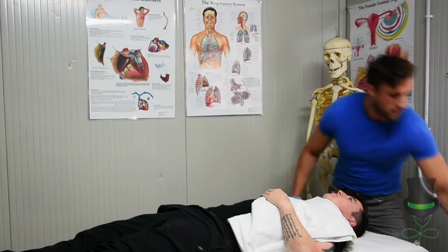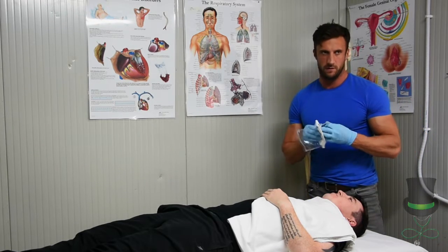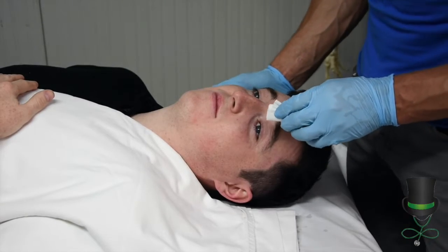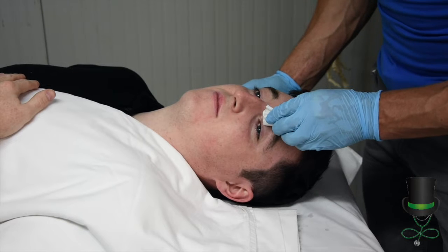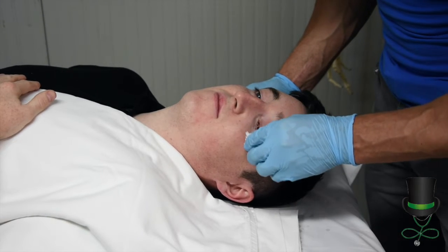Next, with some gauze or a swab, you need to clean the patient's eyelids. First you need to clean around the patient's eyelids to remove any debris and prevent any further contamination.